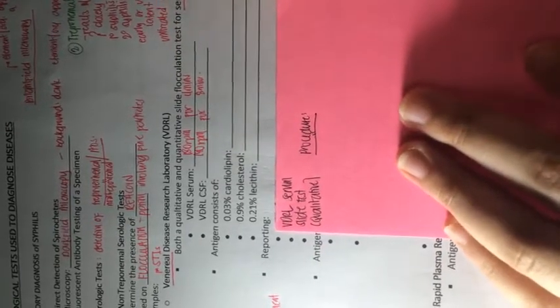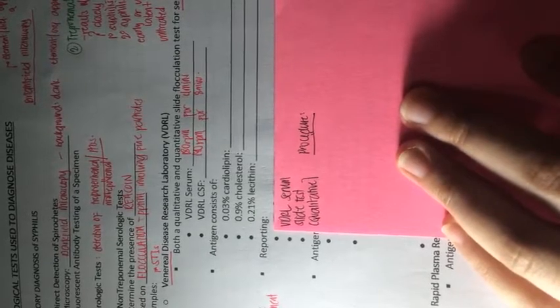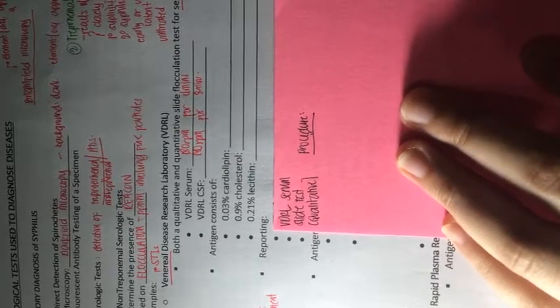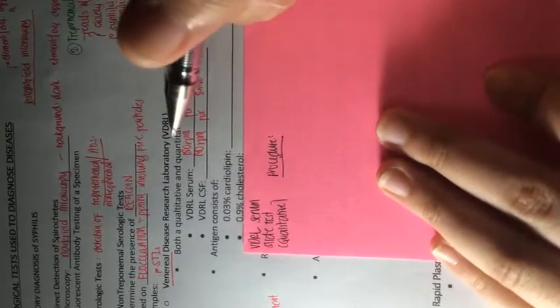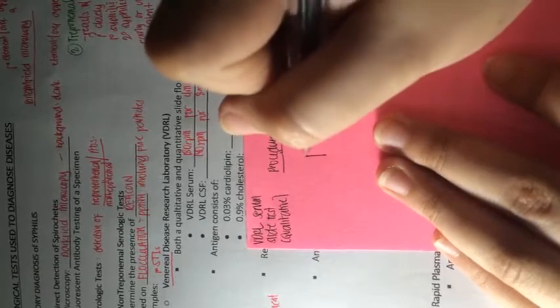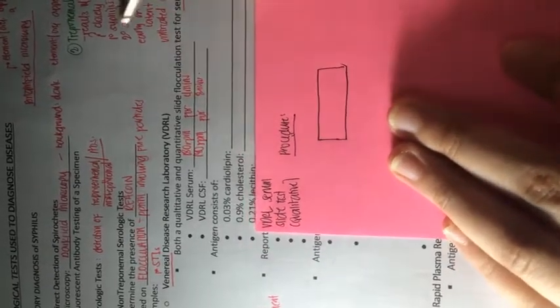It is important to know the procedures in the performance of the different laboratory tests, because during the board exam, they might actually ask what is the solute being used in this particular method, what is the solvent, what is the reacting agent, and what's the expected result. By knowing the procedure, there's no need to memorize all of those things. You just have to be familiar with the procedure, and you will have an idea what the answer would be to those kinds of questions.